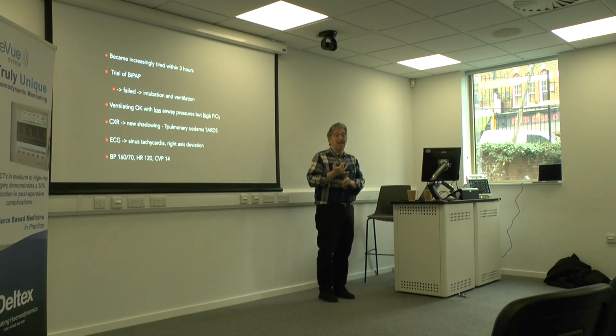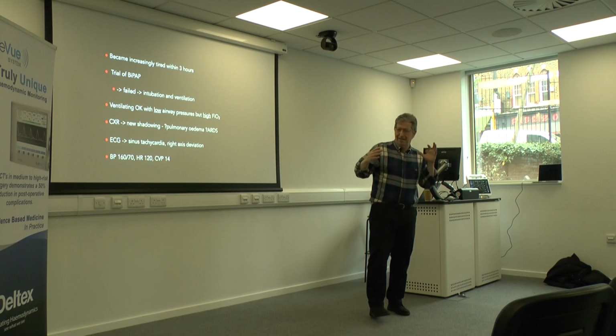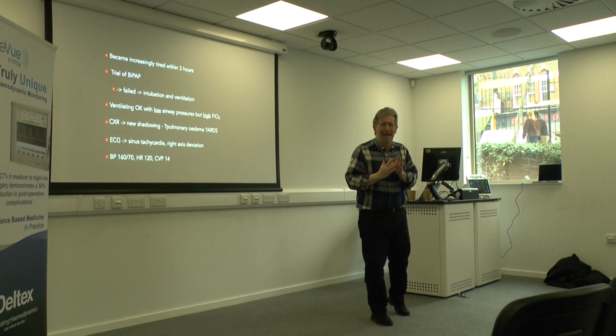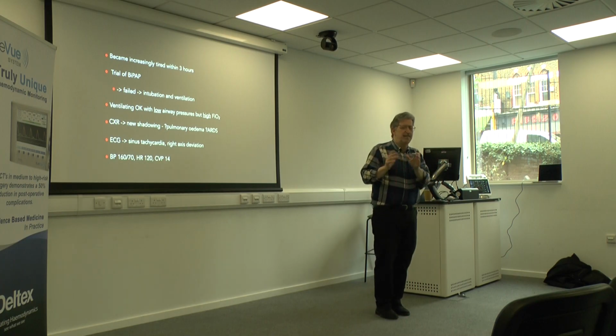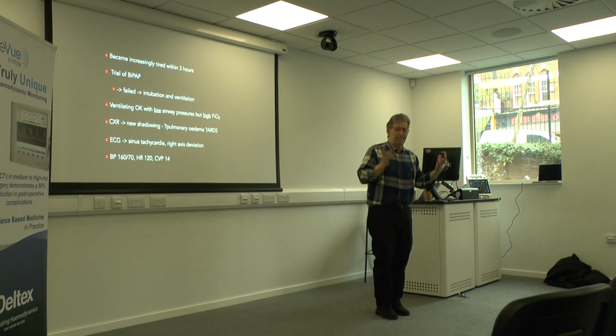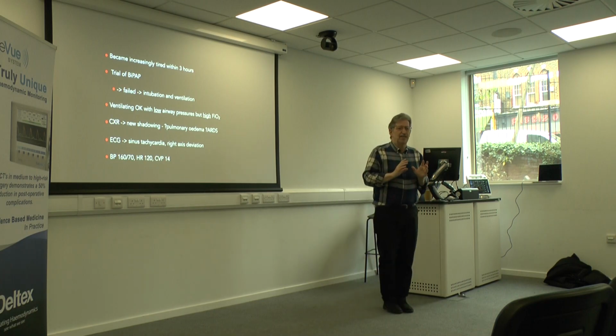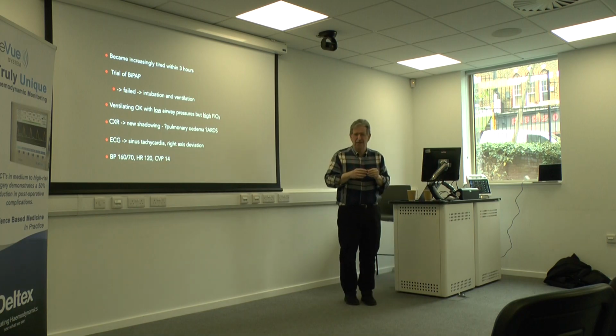So I think it's a lovely diagnostic. And as a monitor, if the walls are collapsing, then it's likely the patient will probably be fine. But again, in assessing a 200 ml fluid challenge, has it made things better or worse? I defy anyone who does POCUS, unless you're doing the Doppler component and looking at stroke distance, to actually say. So wonderful diagnostic in my hands, absolutely. Not so great for monitoring.